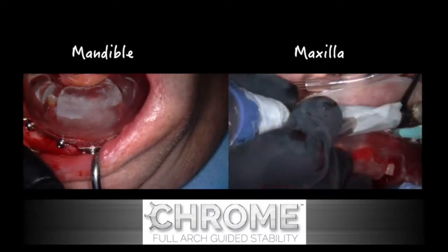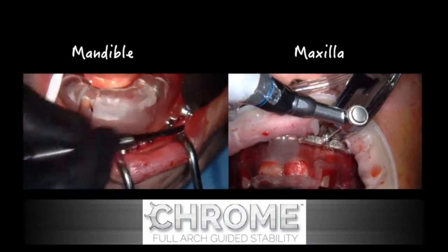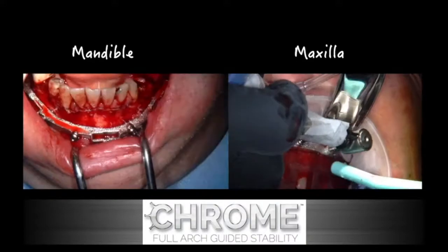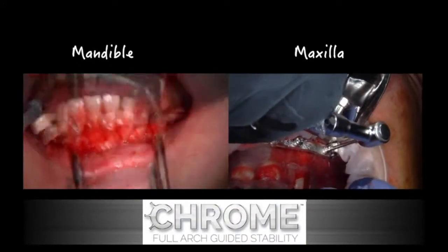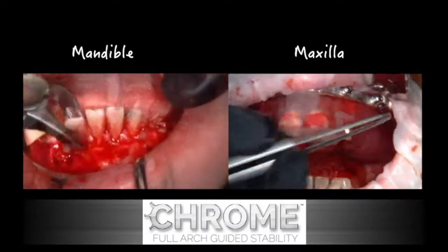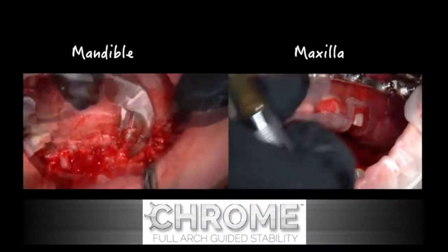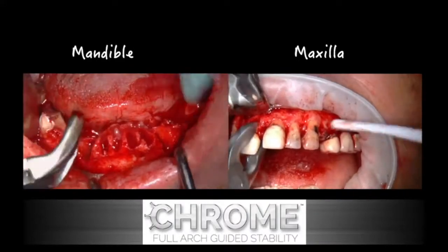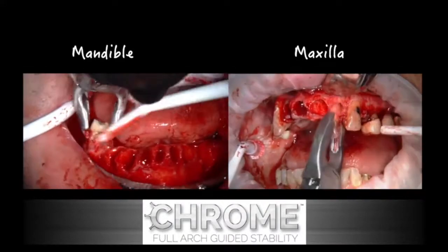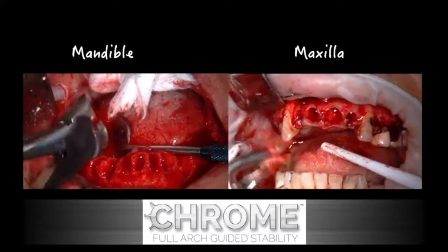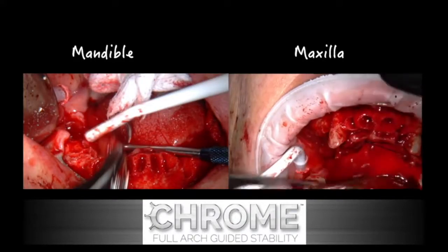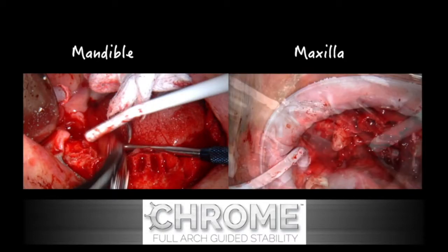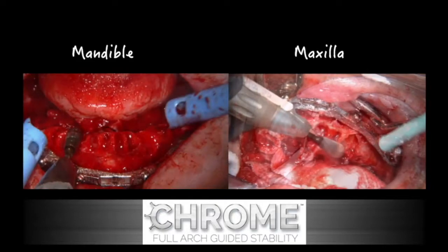You can see the pins will be removed, and the seating appliance will be removed, allowing for total access to extract all of the teeth. You see the windows, by the way, allow the visualization to make sure that each one of these guides are seated properly. And of course, this is very quickly done for the purposes of this lecture, so that you can visualize how all of the extractions are done while the foundation is in place.